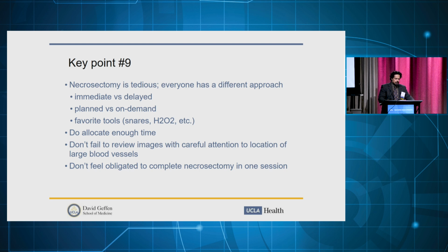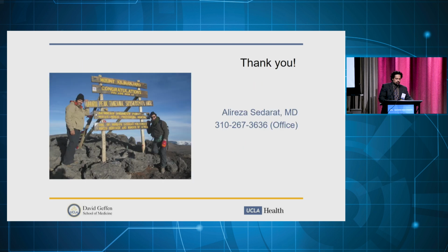What you don't want to do is dig around in there and find that there's the splenic artery running around that you didn't know about and you started to dig into the wall. So looking at the imaging is super key. And you don't have to finish it in one session. I think most of the time you can do what you need to, put a pigtail, give it some more time. And in fact, with time, these things probably soften up. So that's pretty much it, quick and dirty, hopefully put things in perspective. Thanks very much.